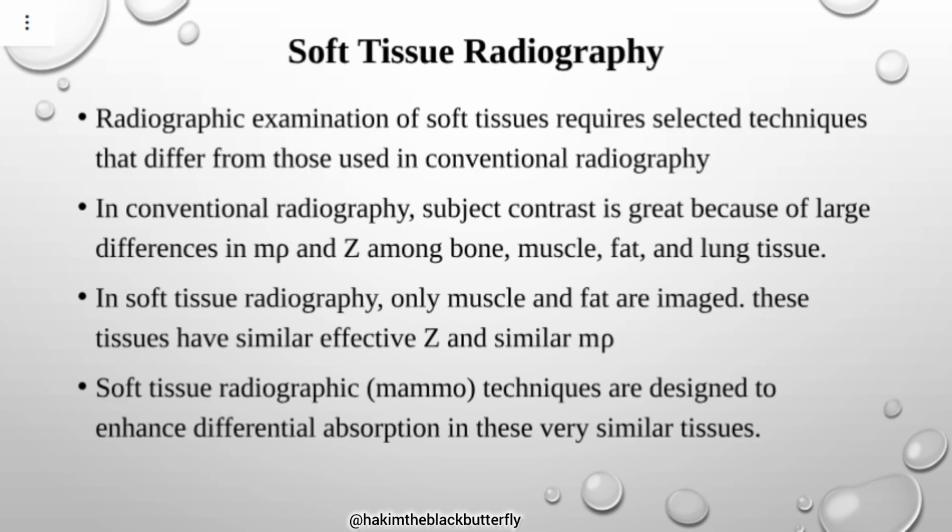So soft tissue radiography techniques, that is mammography, are designed to enhance differential absorption in these very similar tissues.